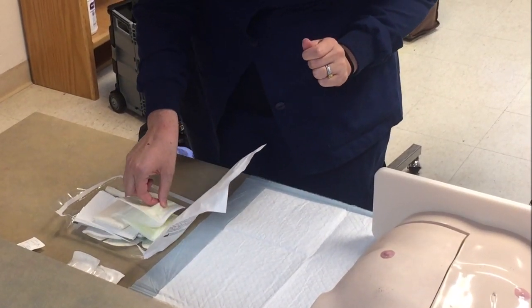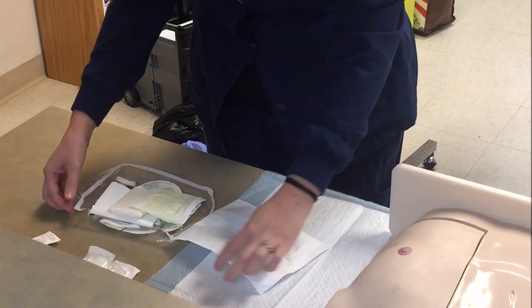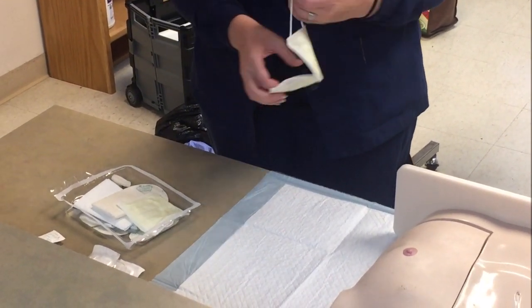After assessing the site, collect all the supplies you need for the procedure, wash your hands again, and now you're ready. First, you'll prepare the supplies using sterile technique.